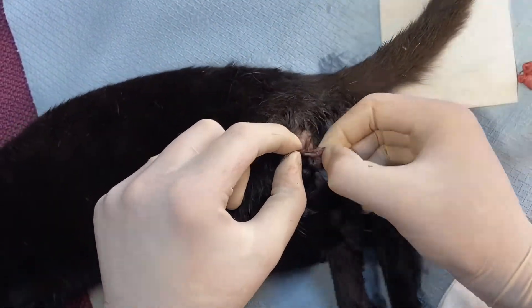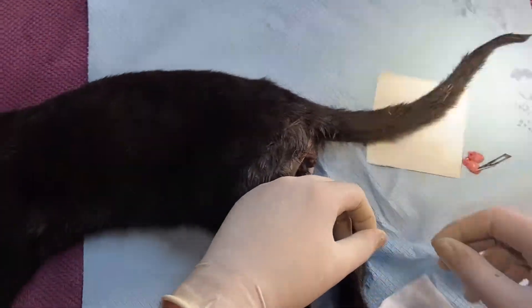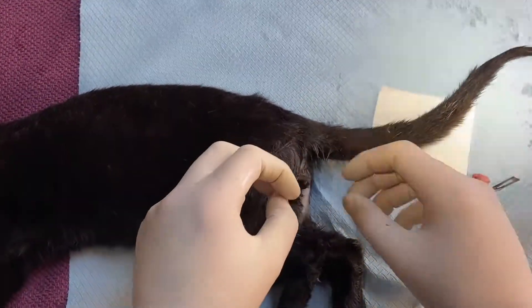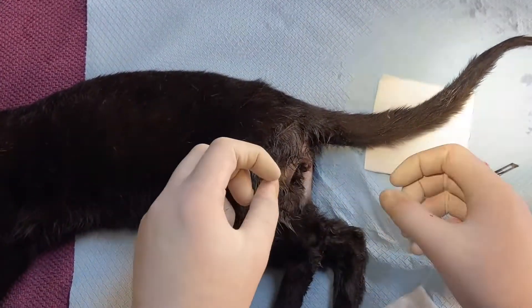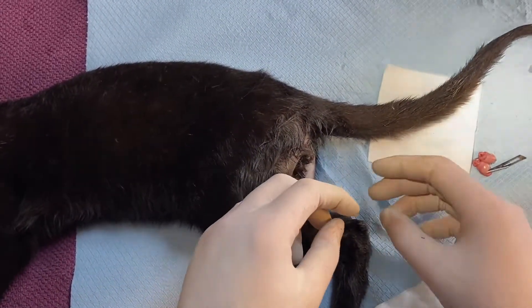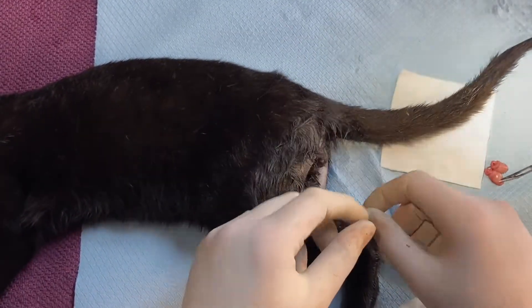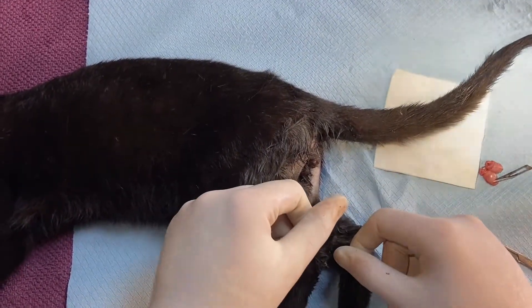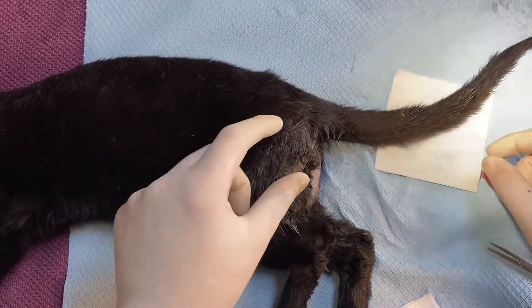If ever it goes wrong, what you do is just put a ligature on. For whatever reason you can't put the ties on, as long as you've got probably at least five on you're okay. But if you've only got two or three it's probably worth putting a ligature on — just some two-nought, two-metric three-nought Vicryl.